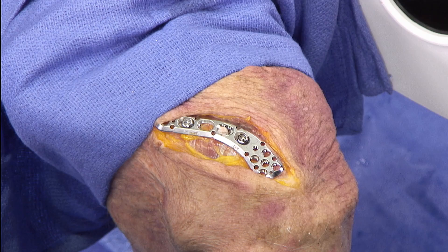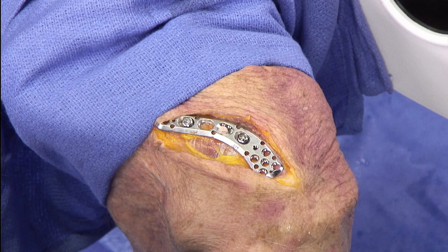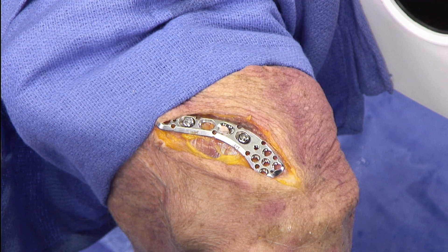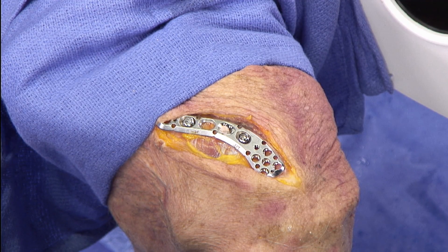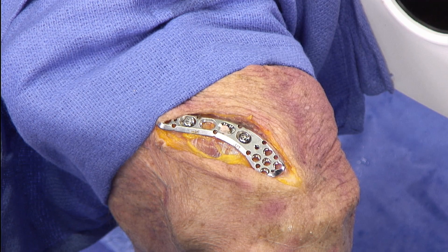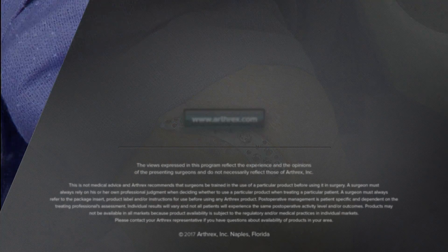Here we have a nice clean trauma approach to 2B distal clavicle fractures where the ligaments have been torn. It allows you to get a nice flexible fixation between your plate and the coracoid distally. It's simple, it's easy, it's reproducible, and with the basic trauma skills that we all have, it can be done in a safe fashion.